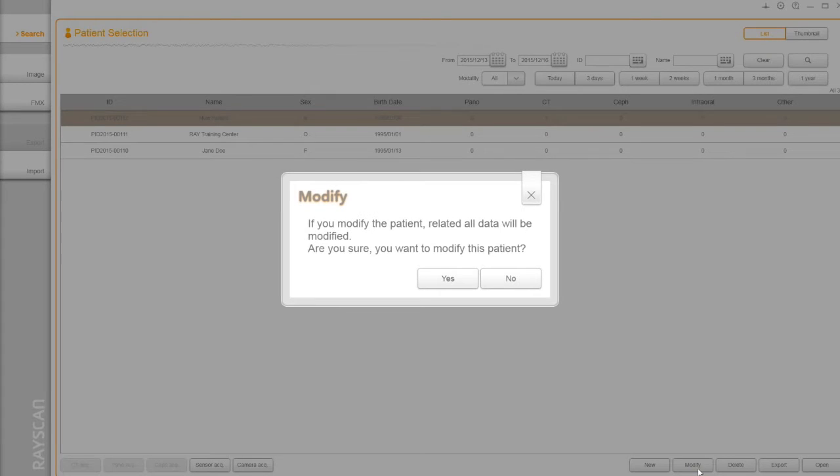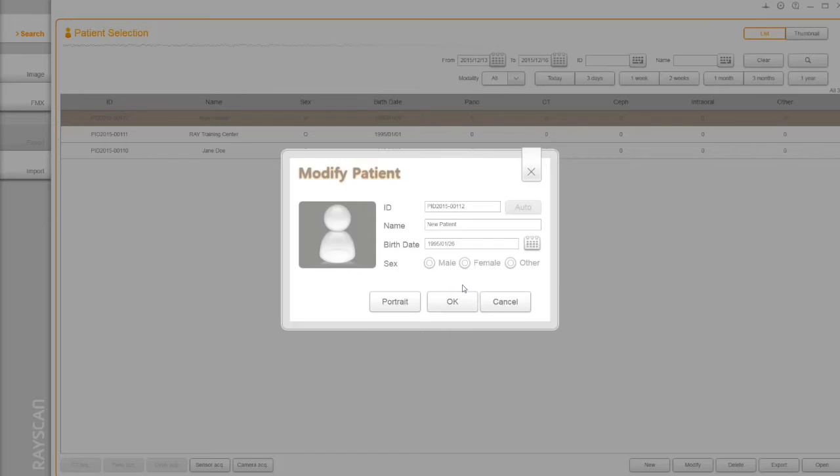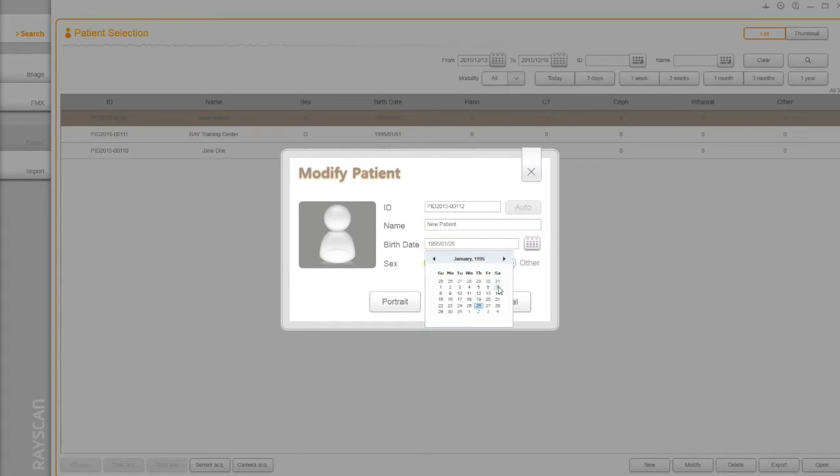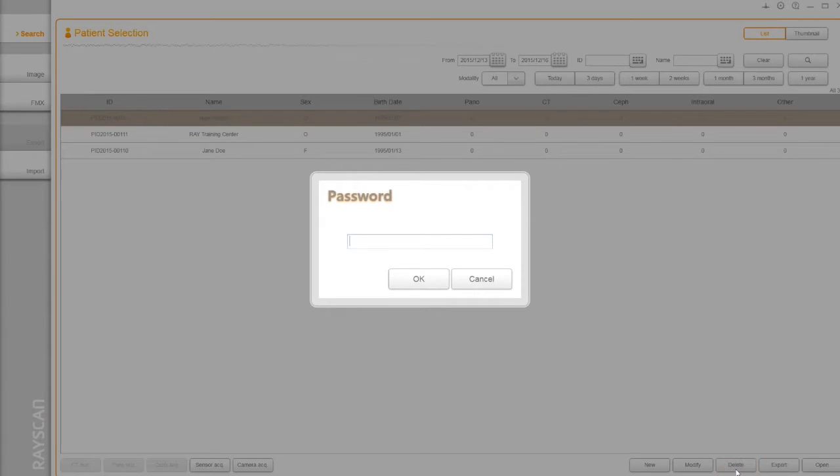Modify button allows you to change information. Note, once you register in the system, you can't change the patient ID. If you need to delete a patient, please contact your representative.